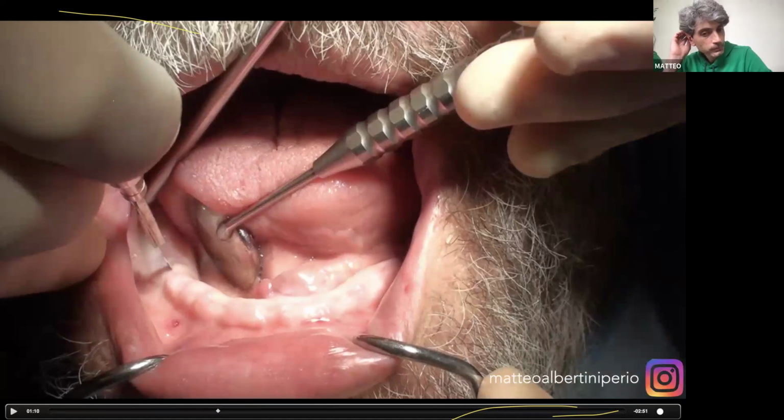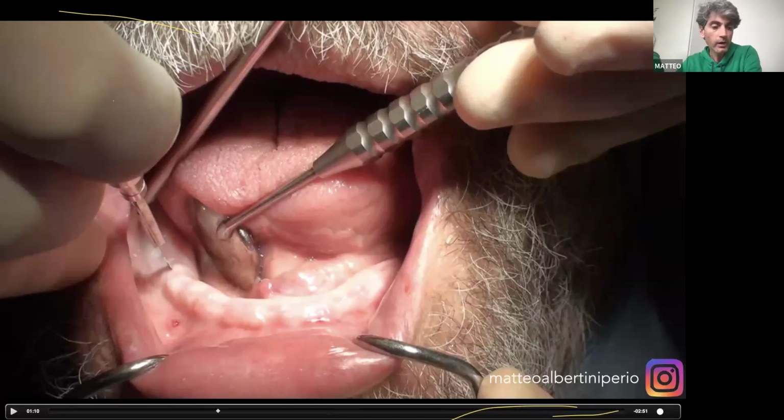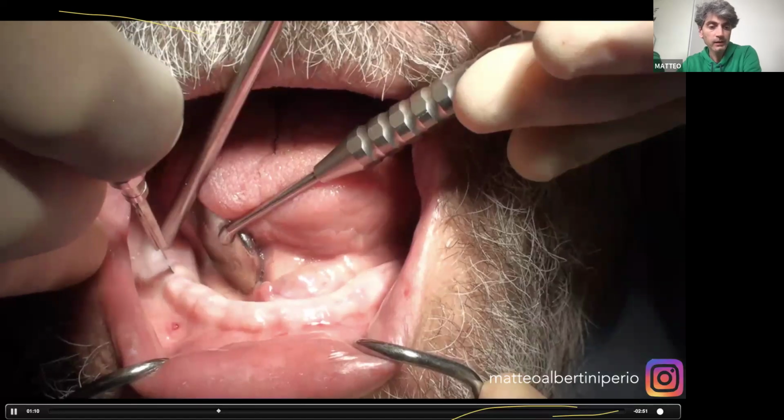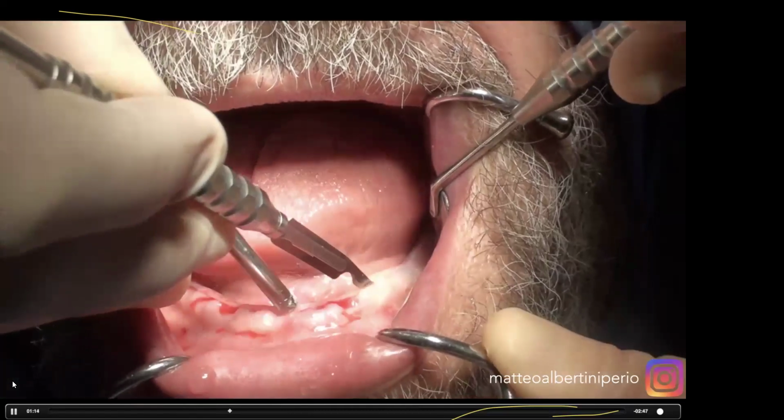Then in the mandible, as we saw before, we don't have so much bone availability in a horizontal way. Да, и далее, как мы помним, на нижней челюсти у нас по горизонтали может быть не столь хороша костная ткань, есть определенный дефицит ее ширины. So we are raising a full thickness flap. Поэтому мы решили провести отслаивание полнослойного лоскута.